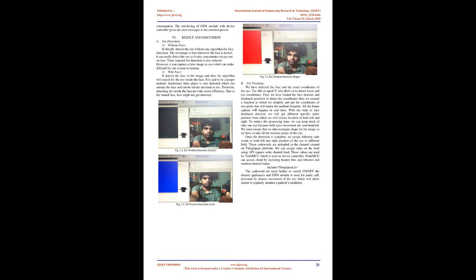B. Raspberry Pi 3B model processor. Libraries available for Raspberry Pi make it more efficient as compared to other processors. It has 1 GB RAM and BCM43143 Wi-Fi on board. It also consists of a micro SD port for loading the operating system and also storing data.